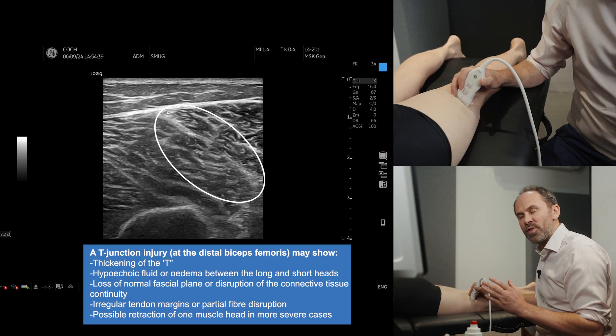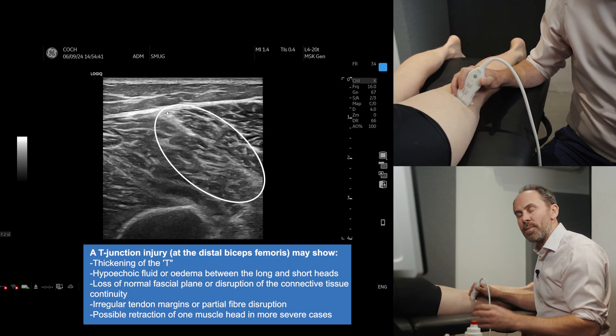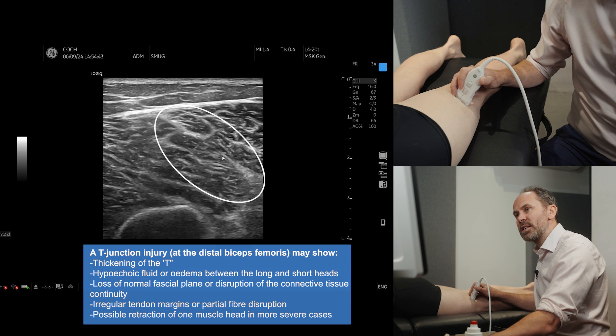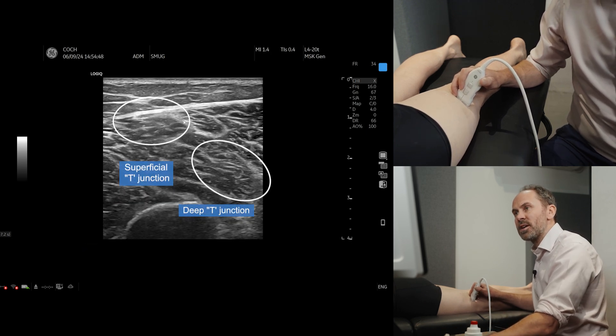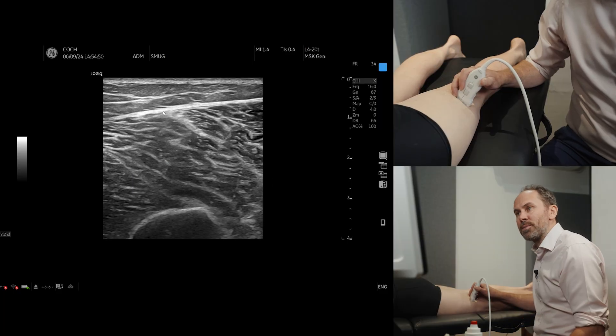If they're located more superficially, they can be a longer time back to playing. If they're slightly deeper, they can have a slightly improved prognosis, but obviously it does vary. So that is the T-junction area of the hamstrings.